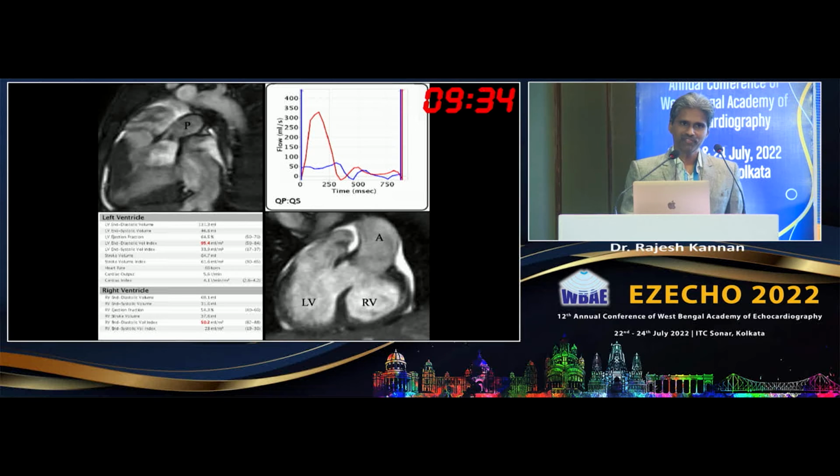Not only that, for the surgeons, by looking at the LV to aorta route, we can see any tricuspid valve or any conal tissue coming across the LV to aorta route. All this information can be assessed comprehensively. And of course, we can use this MRI data for 3D printing models to plan further surgery.